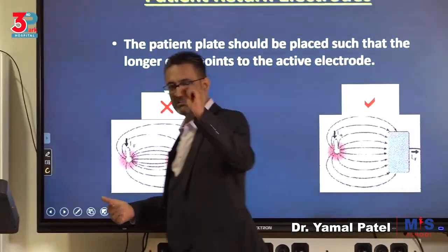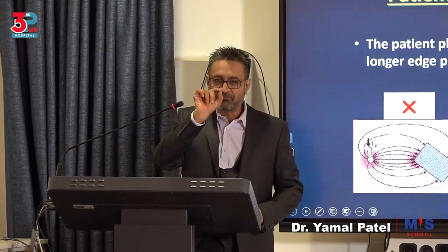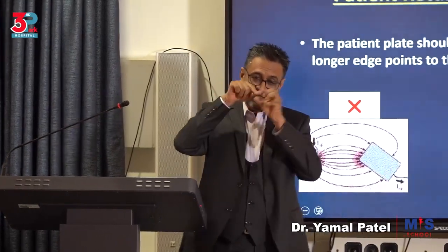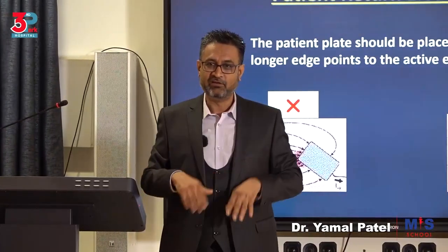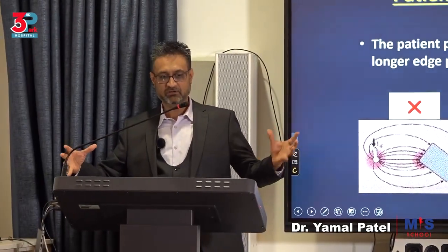So simple things. Do not put it at an angle because you don't want a fine in and a fine out scenario. You've understood what I'm saying? Whenever it's fine in, it burns. So if you give them a fine out scenario, it will burn. Give it a broad out, okay? And it will never burn.